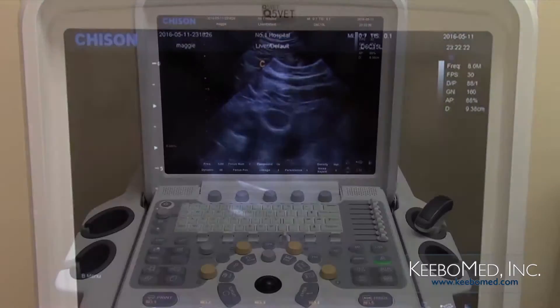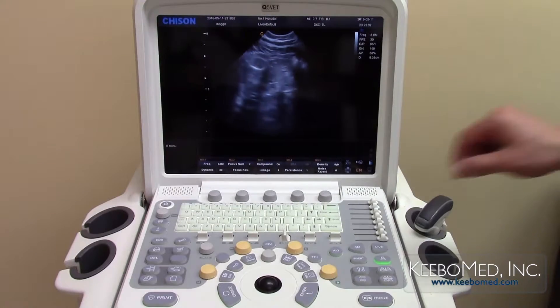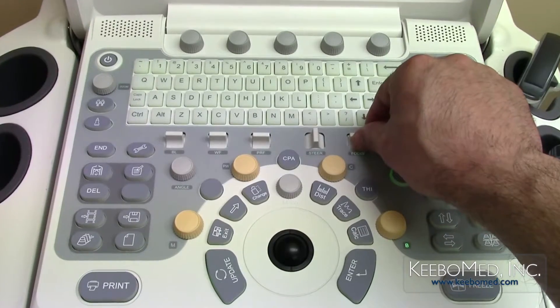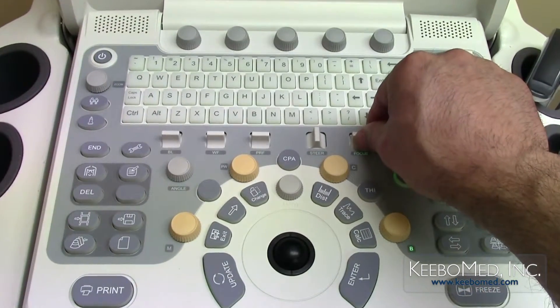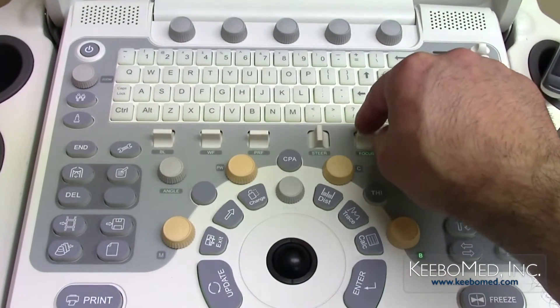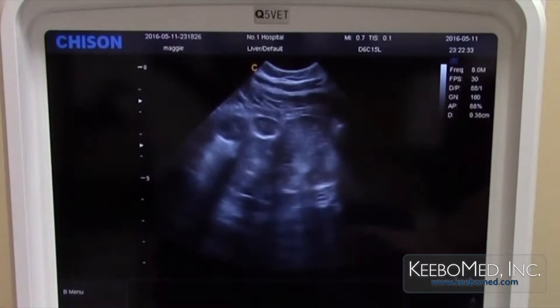Number 4: to the left of the depth button is the focus position button. Moving it up or down allows a specific area to become clearer.